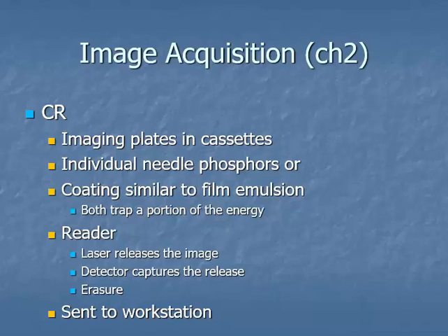Medicaid and Medicare reimbursement prefers digital radiography over computed radiography, so your hospitals are making the transition, or have made the transition, primarily to digital imaging as opposed to computed radiography. Computed radiography is still on the registry, so we'll talk about it.